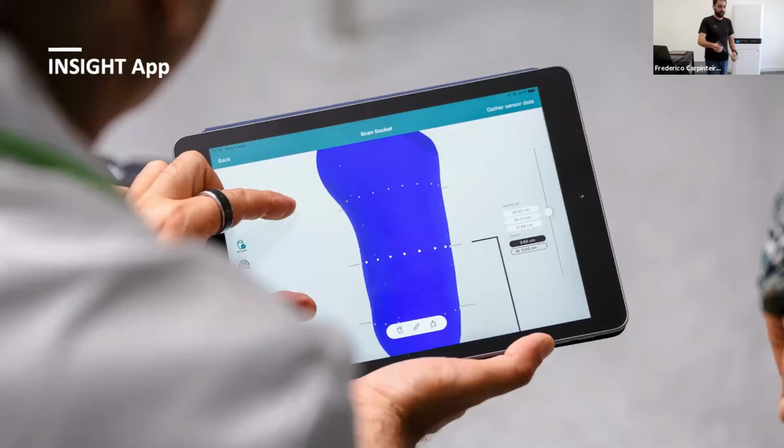So now moving on to the app. This is the most comprehensive part of today's presentation. I will start by going through all the menus and all the features, and then in the end, I'll screen share the app screen and do all those actions for you to see how easy it is to do. So next slide.